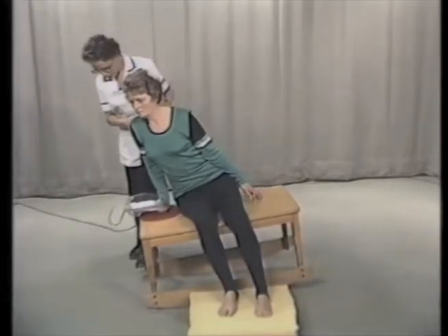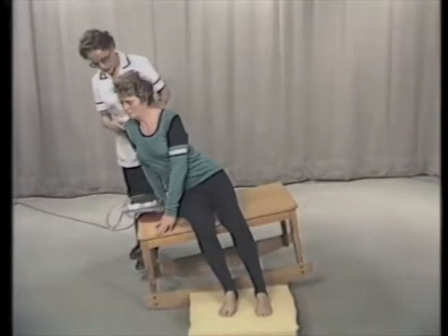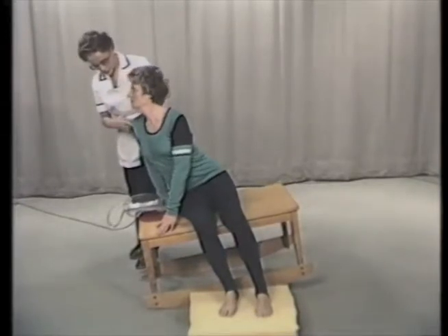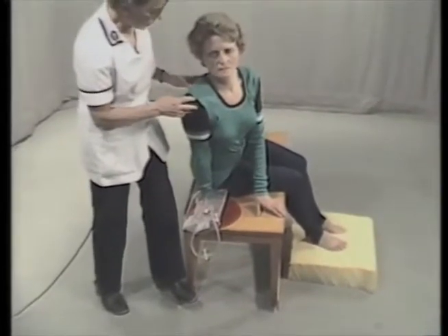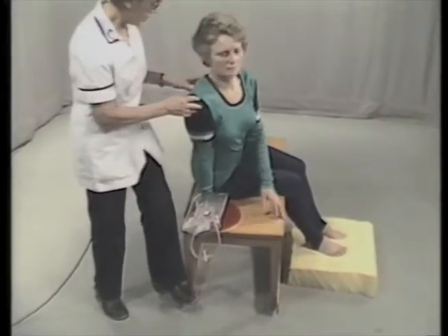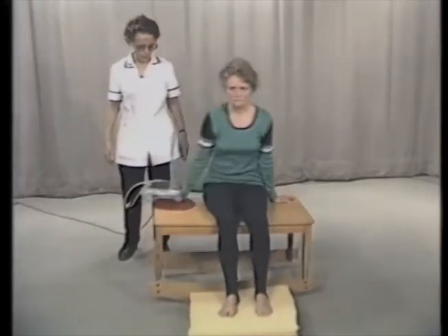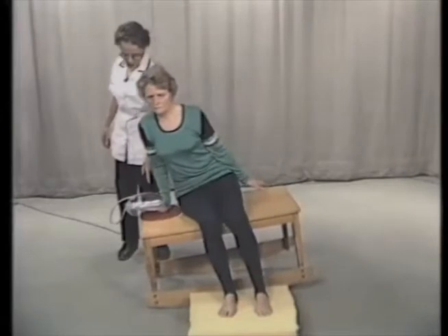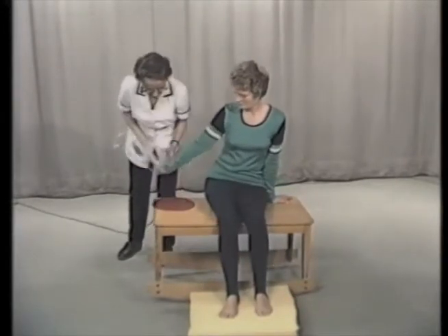I can hold the stool with my foot on the rocker and get the position I want. Particularly if she doesn't want to transfer, I'll be encouraging her. Put your hand back again and go back into rocking. And again, the small hand splint is maintaining the position on a non-slip mat.